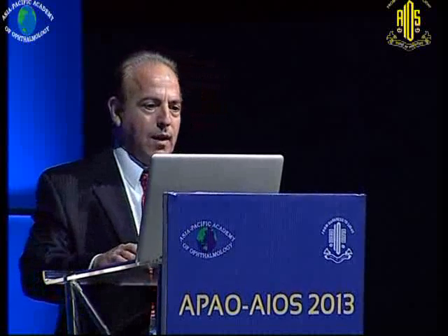There are many types of vitreomacular traction. Here we see a patient where we can see the traction band, we can see the retinal striae being drawn into this, and of course on OCT we see very well the traction. This is an older time domain OCT, and even with that instrument we can see very well the nature of the vitreous attachment, and that this may be found in combination with epiretinal membrane.